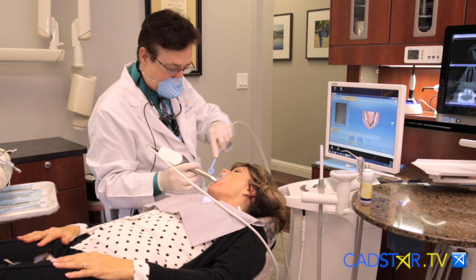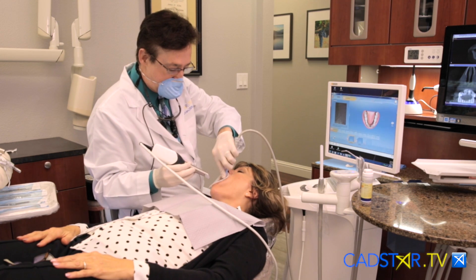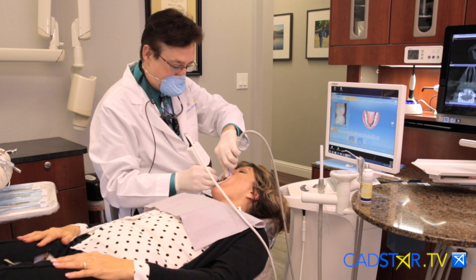So with a large dry aid, this saliva ejector mirror, and the OptraGate, I'm in full control when I'm taking that OmniCam optical impression. You want to control your saliva and your moisture — that's how you get your OmniCam optimized in that clinical field.